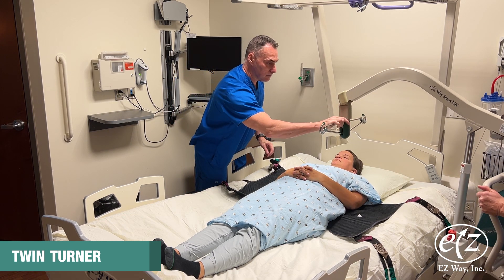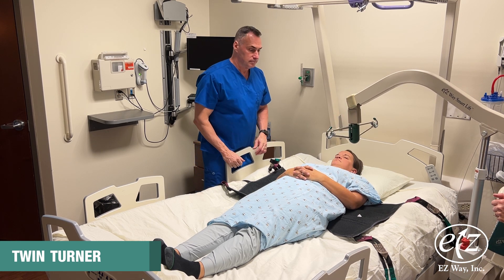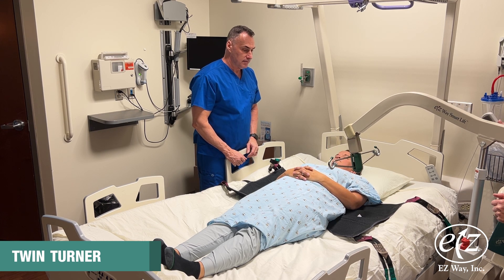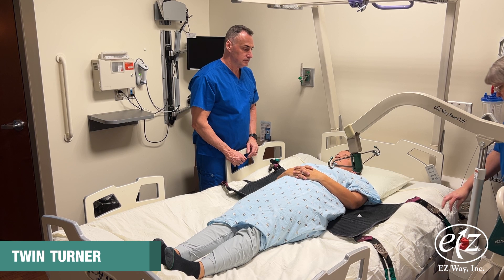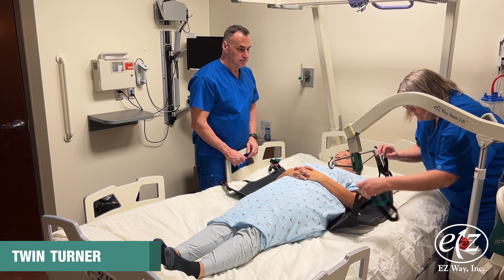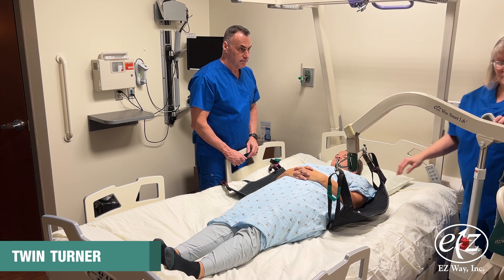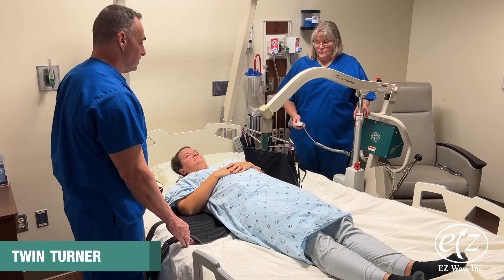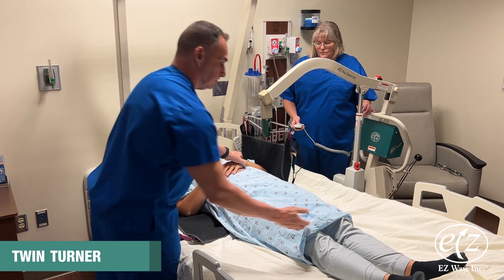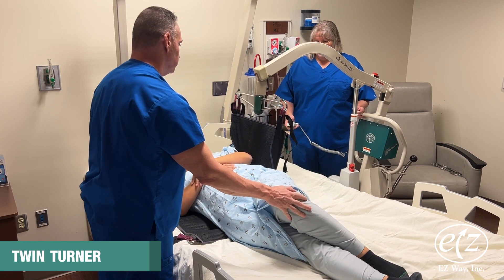Bring the lift to the opposite side of the bed. Remove the sling hangers and attach the sling loops on the hanger bar. Raise the lift boom slightly. Once there is tension on the loops, pause lifting and double check to make sure the loops are securely seated in the hooks.